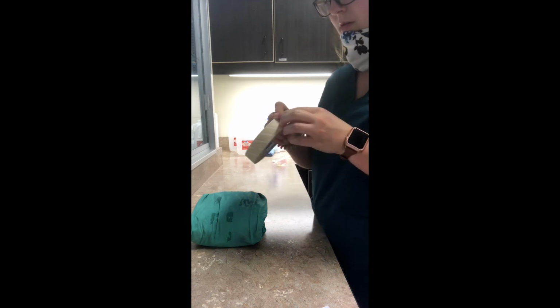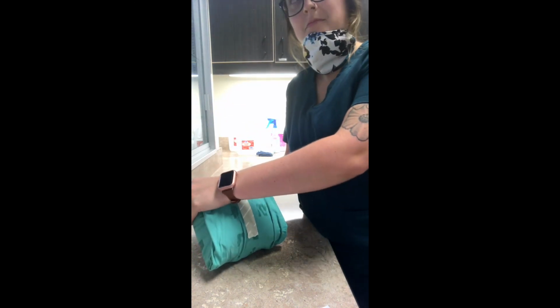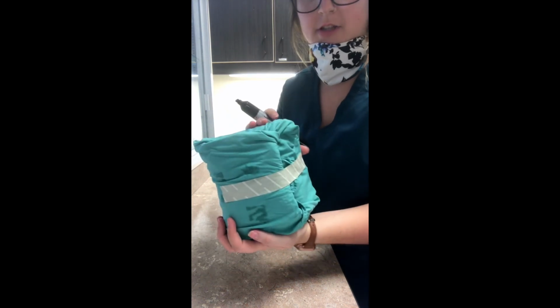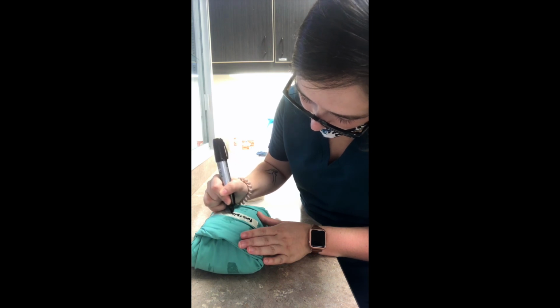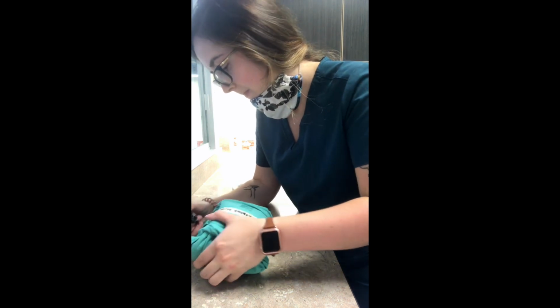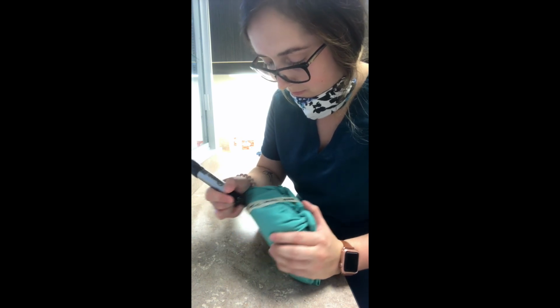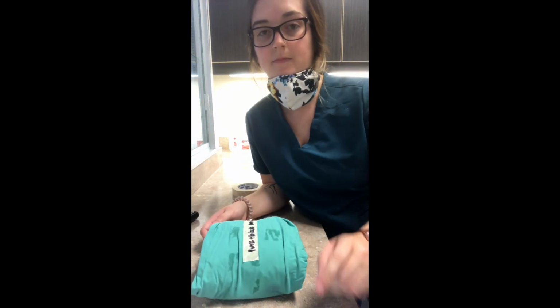Here's our pack that is wrapped. With the indicator tape, I'm going to label the pack with my initials and the date. Then we'll go ahead and autoclave this.